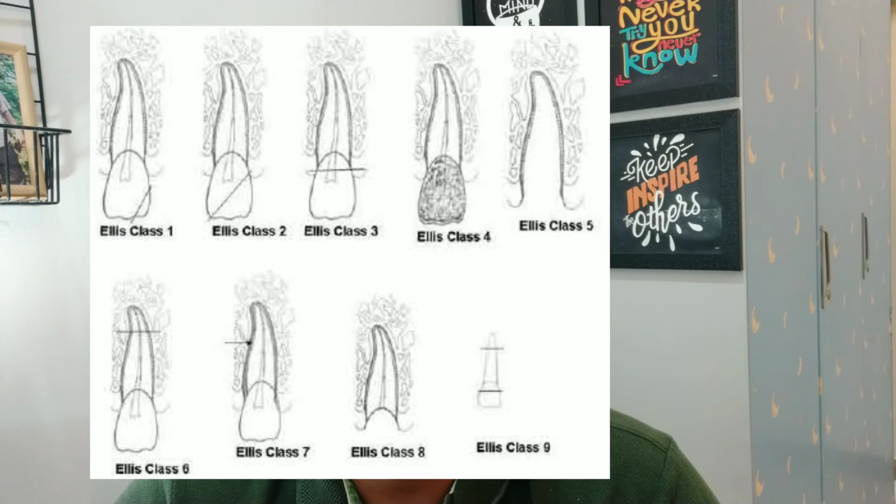First of all, we will start with the most common anterior tooth which you really get happy about, that is the upper anterior tooth. If you get one in your clinic, you'll be very excited. Okay, it's very easy. But guys, a lot of perfectly done anterior root canal cases also fail. The reason I'll be telling you.